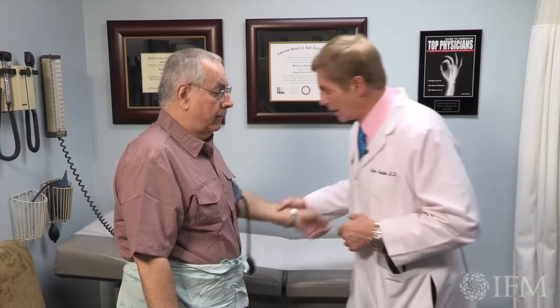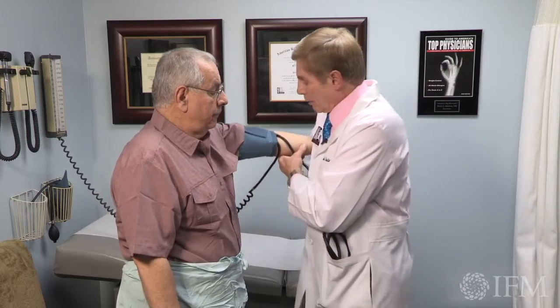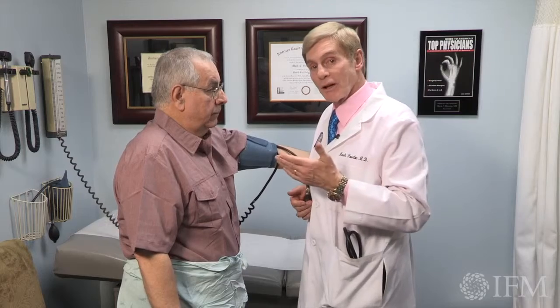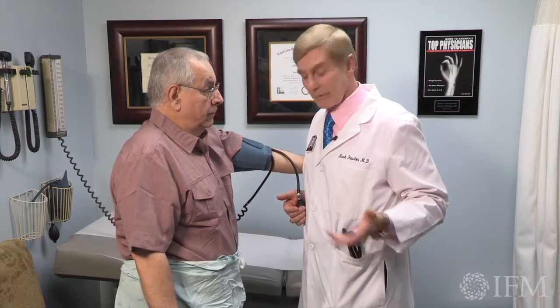Same technique — remember the cuff is appropriate size. A lot of times you'll have a problem with this if the patient's really tall or too short; it's hard to get this locked in. So what I have in all the exam rooms is a step stool, and I have either me stand on it or they stand on it. If I have some six-footers, you know, they're going to be like this.